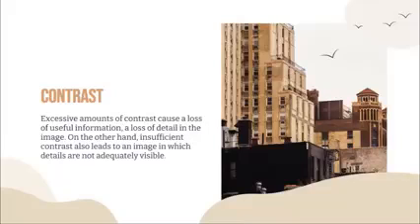Excessive amounts of contrast cause a loss of useful information and a loss of detail in the image. On the other hand, insufficient contrast also leads to an image in which details are not adequately visible. Okay, so with an excessive amount of contrast, that means high contrast, short scale contrast. Pag sobra kaayo, loss of information. Okay, saturated na ang inyong image. Okay, there will be loss of detail, then hindi mo ma-identify kung which is which.